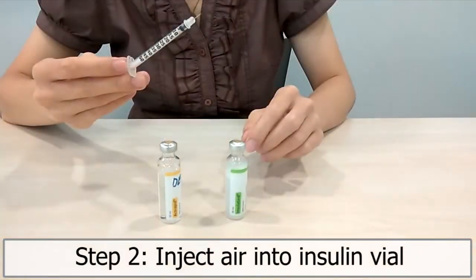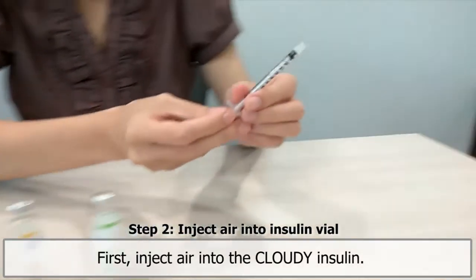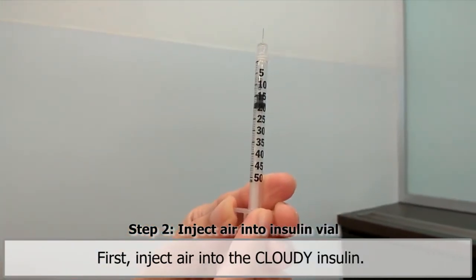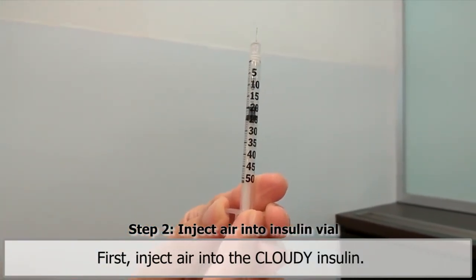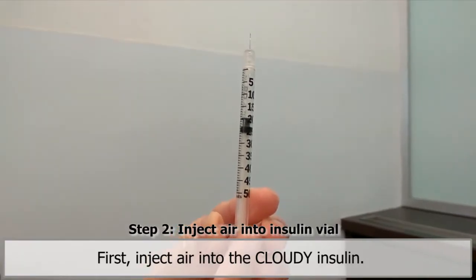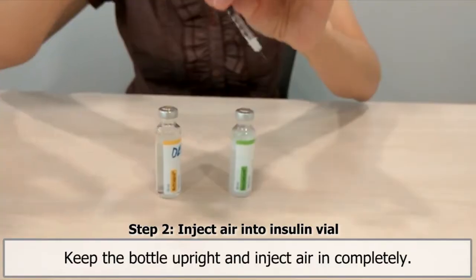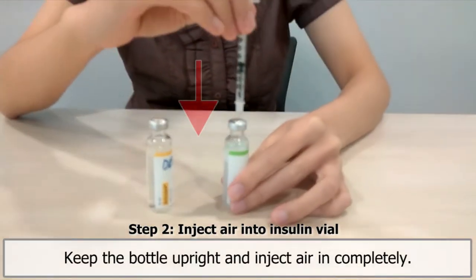Step 2. Inject air into insulin vial. First, inject air into the cloudy insulin by pulling the plunger to the same amount as the prescribed insulin. Keeping the bottle upright, inject air into the bottle by pushing the plunger down completely.